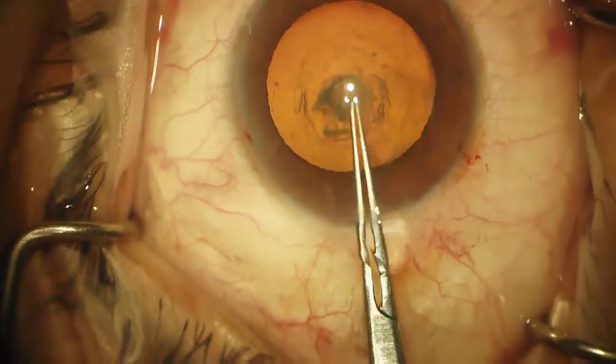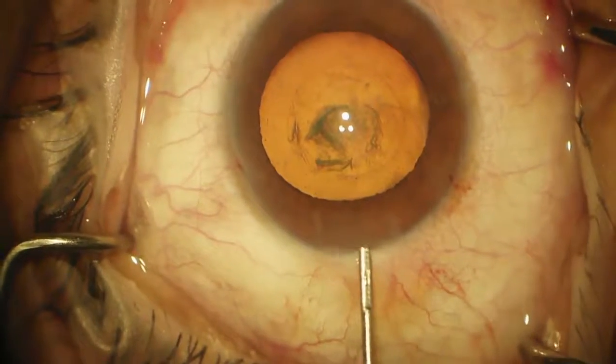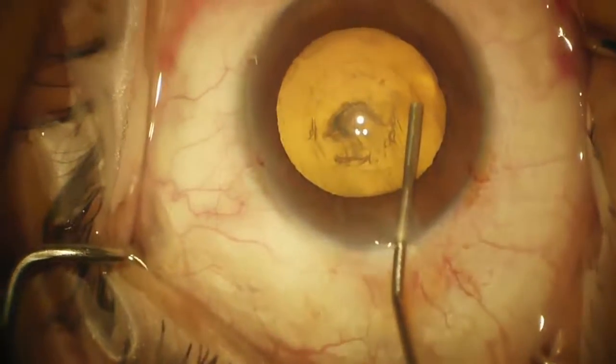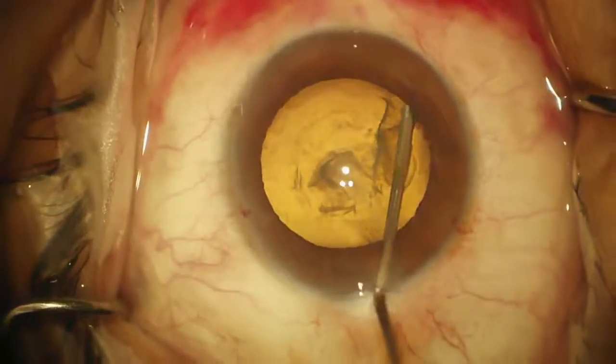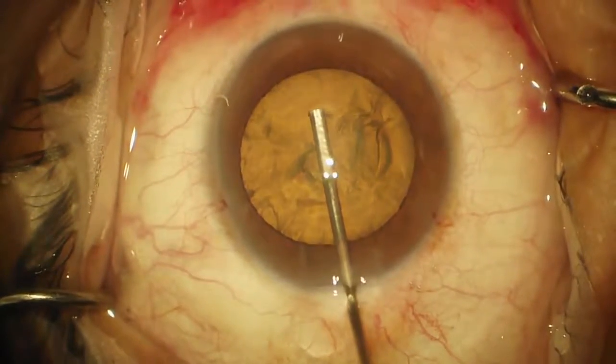I like to just pull the remnant out. Next we'll do a hydrodissection — you should see a nice fluid wave. You can see a very nice fluid wave, and then I like to push down right in the middle.